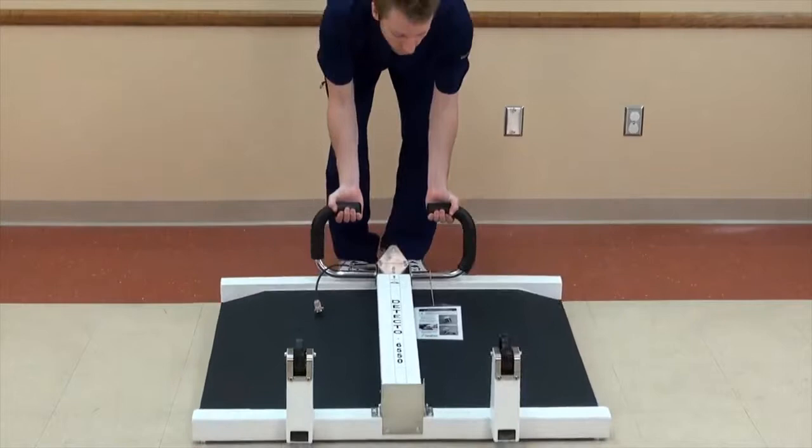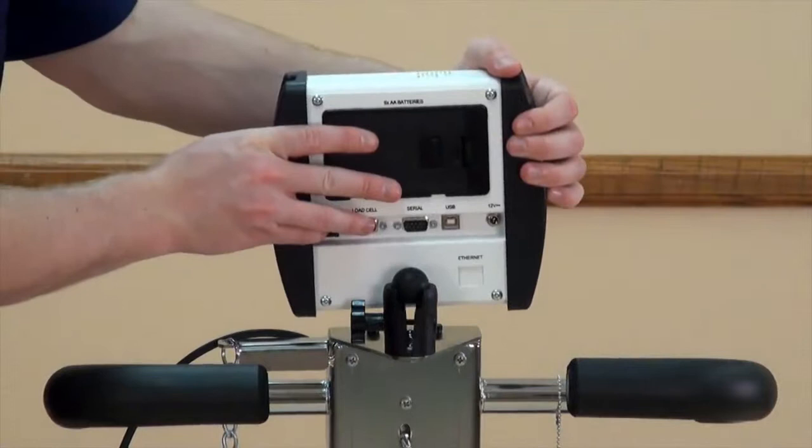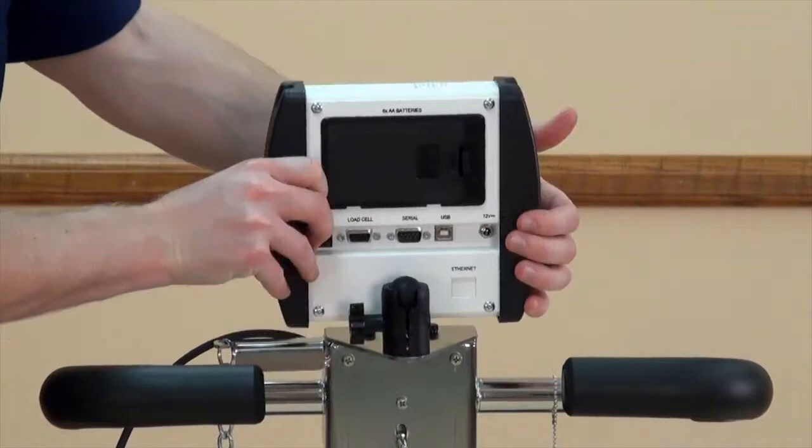Before attaching the indicator to the scale, you must first lay the entire scale unit down and raise the column as shown. Place the indicator into the ball socket mount on the top of the column and hand-tighten it in an upright position.